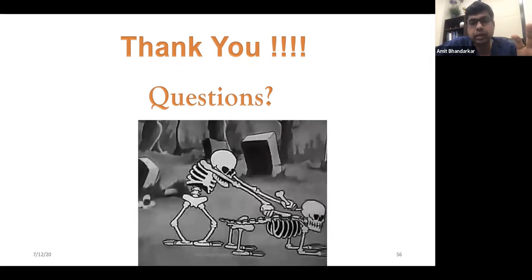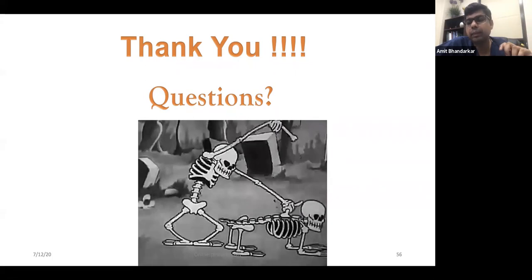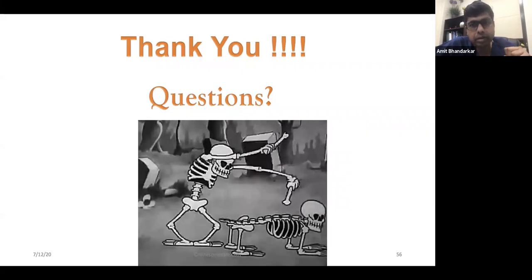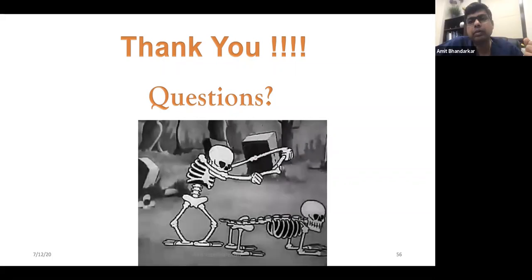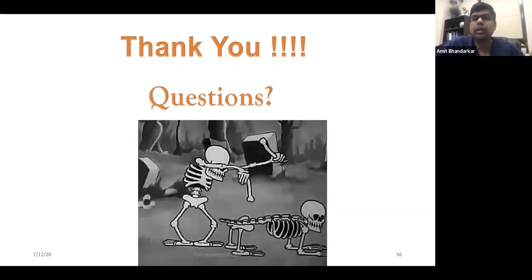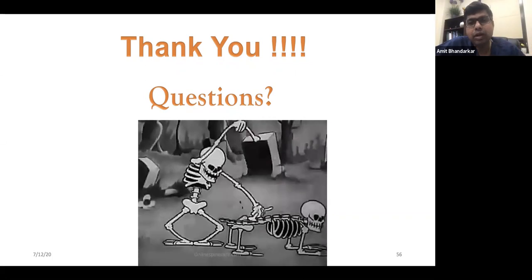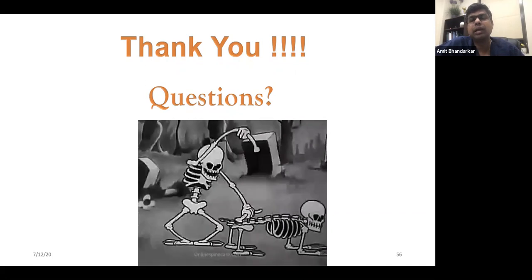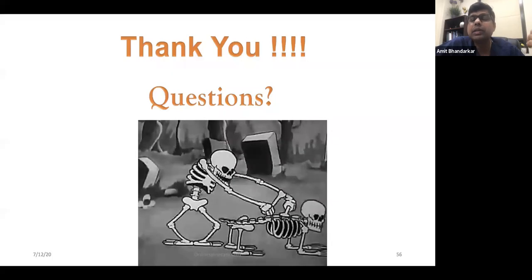Am I 100% successful in that? I will not say that, but I think I'm doing better by the day, understanding the pain generation. If you understand that the patient is possibly coming from some stenosis in the foraminal area, then we need to add that to what we're going to do at the TLIF level. Say the patient doesn't have foraminal stenosis, just has instability there, I may even just go ahead and do a fixation, as you said, not an interbody cage, and the patient will be just fine.